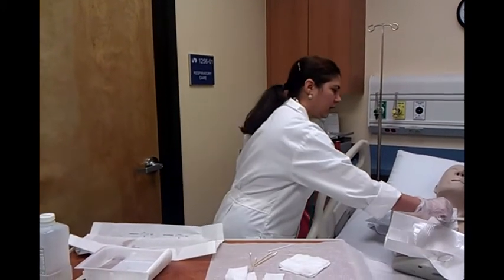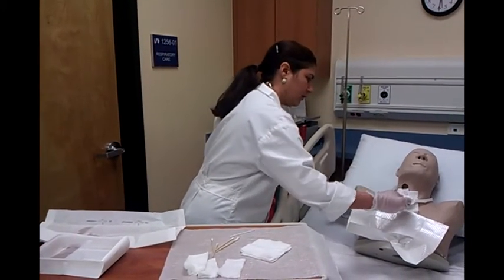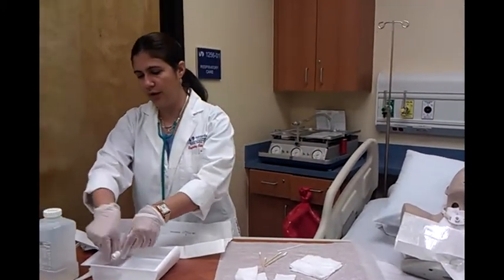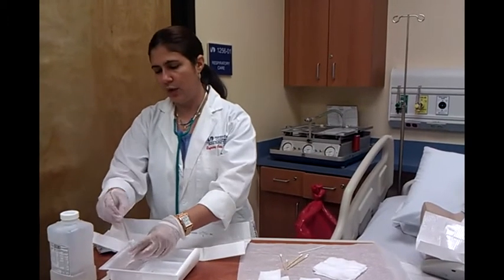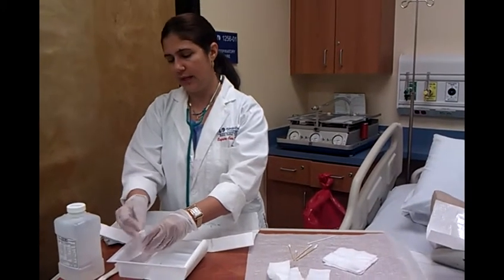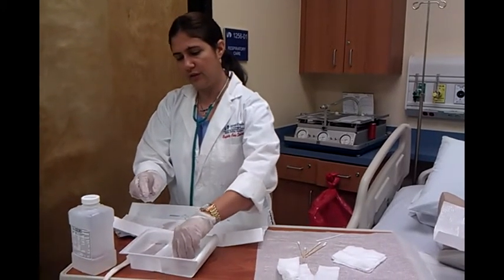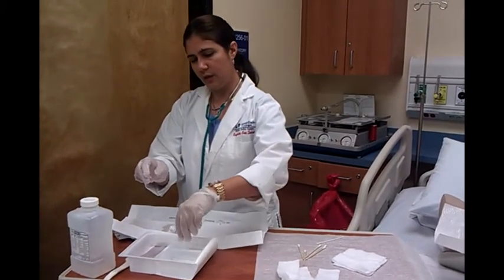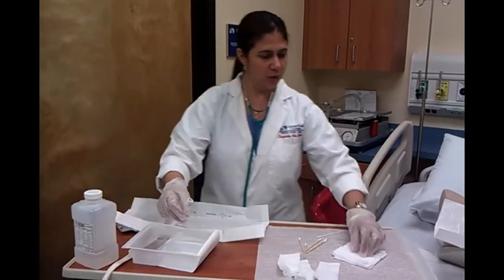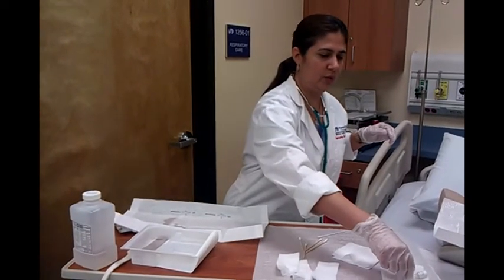I'm going to remove the inner cannula. I'm going to put it in the compartment with hot sterile water and peroxide. I'm going to clean inside with a brush to remove all secretions and mucus. Outside, I'm going to rinse it in the sterile water compartment, the second sterile water compartment, and after, I'm going to put it on one of the sterile gauze to dry in the air.